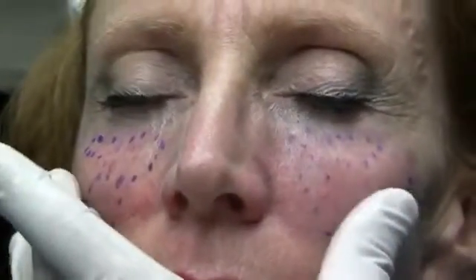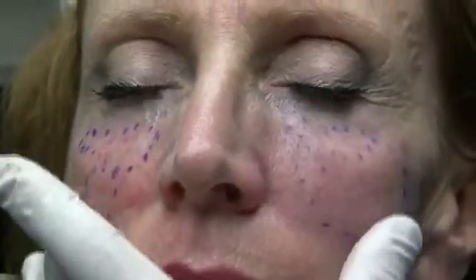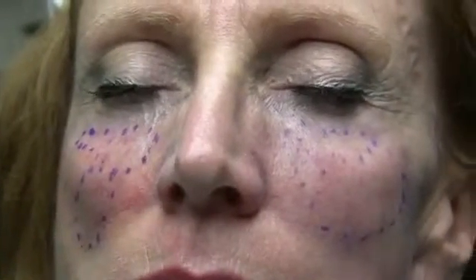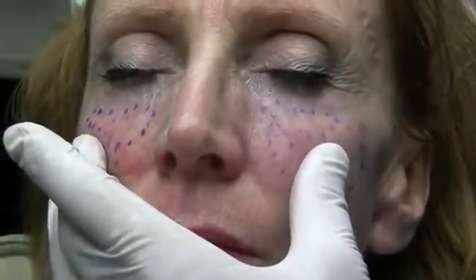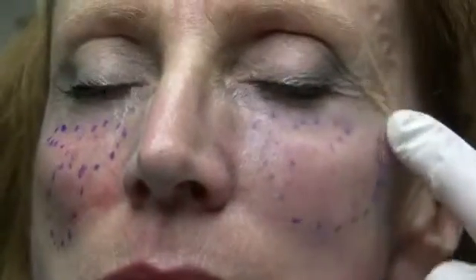But for situations like this, there's no better non-surgical treatment. I could treat this patient with some customized implants, some off-the-shelf cheek implants, and a little facelift, but for a fraction of that price, she's going to get a nice correction here for a while.